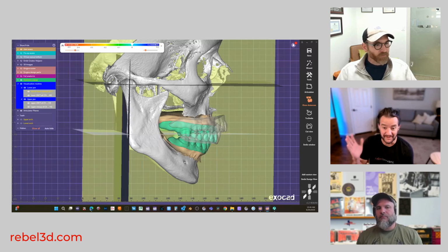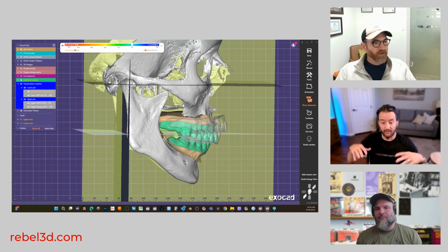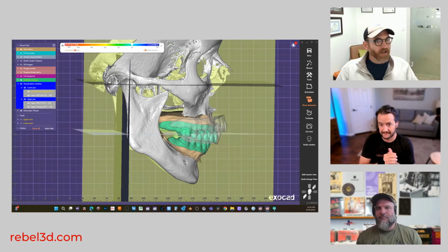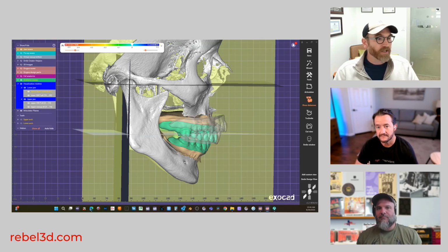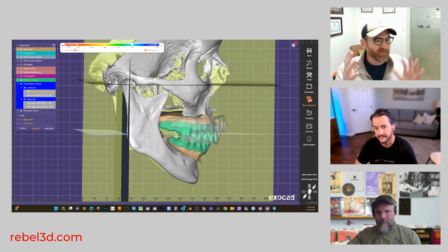Any rule of thumb? I know we've talked about this before: if you're going to arbitrarily open the bite digitally more than X, then you should really use leaf gauges. Yeah, I'd say if you're going to open anything more than like 3 millimeters at the incisors, that's quite a bit at the pin. So 4 at the pin and less is probably meh.